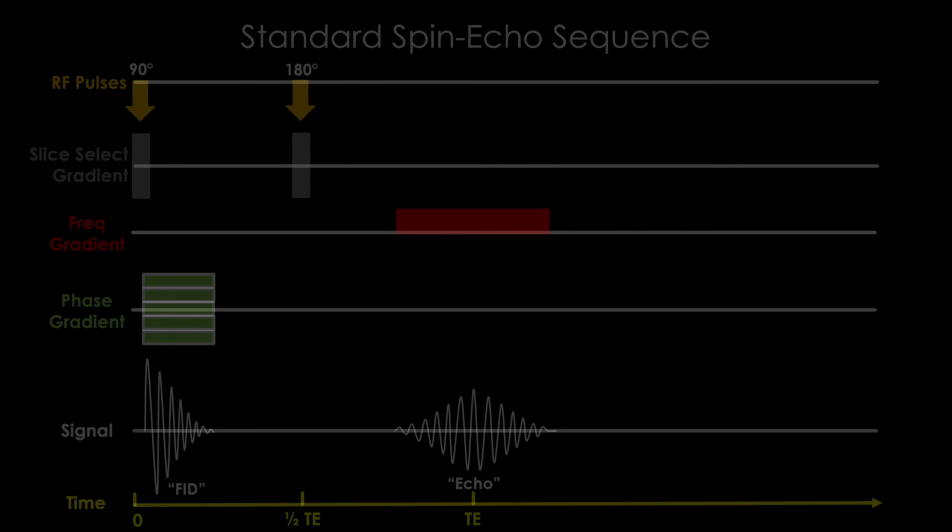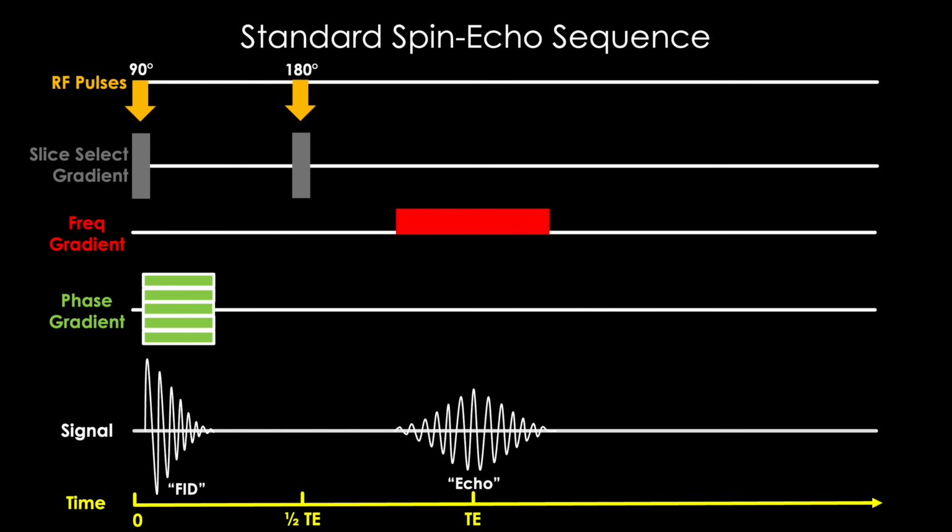Let's take a look back at our pulse diagrams, this one of the standard spin echo sequence. Remember that we need to apply these two gradient fields as part of the sequence, traditionally labeled our frequency encoding gradient and our phase encoding gradient. These are really oversimplified terms representing the k values we are generating at these time points within the pulse sequence. Note that it doesn't matter which one we pick to apply where. Kx, which contains the gradient field across the x-axis, can be applied here, and vice versa with ky.